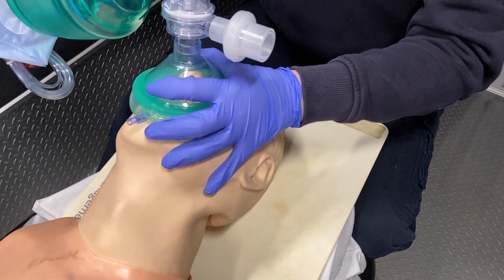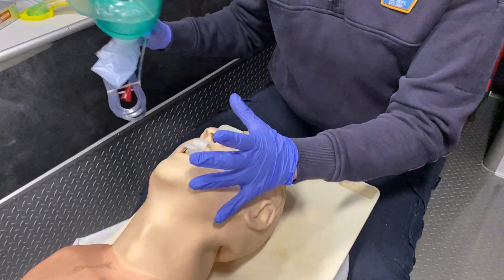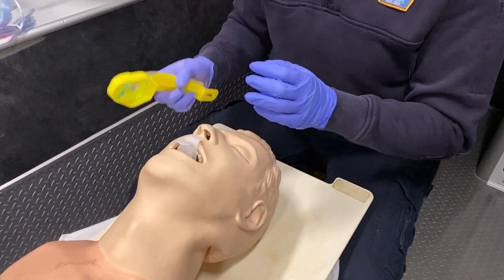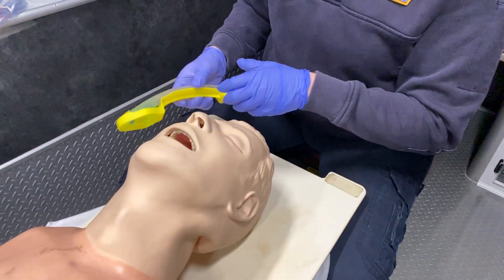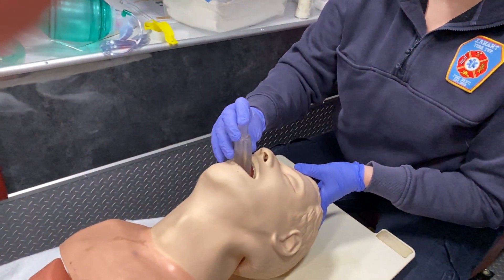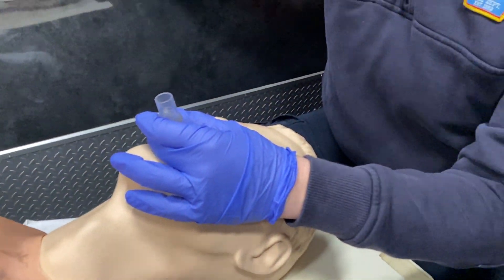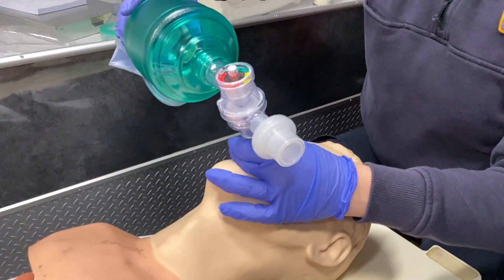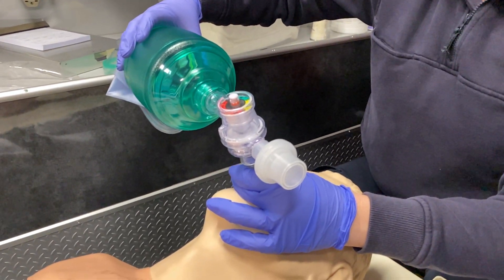Now that the oral airway is inserted, prepare to insert the supraglottic airway — pass off the BVM to your partner. Check your equipment; you can lube the end of the i-gel, but it's already pretty moist. Remove the oral airway, apply some pressure to the back of the forehead for easy insertion, and insert down to the line indicated on the i-gel. Slide the head back to neutral position, attach the BVM, and ventilate once every six seconds.